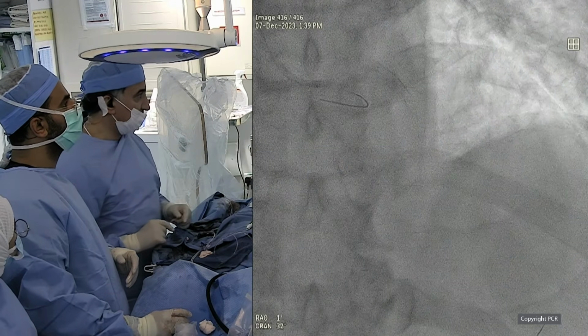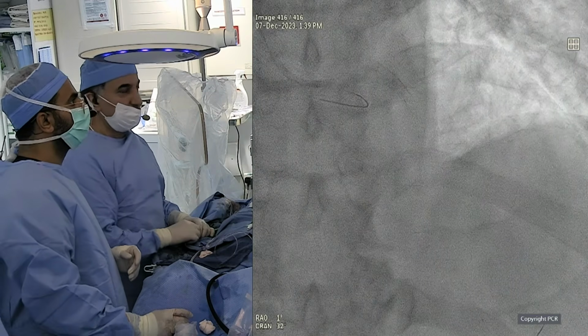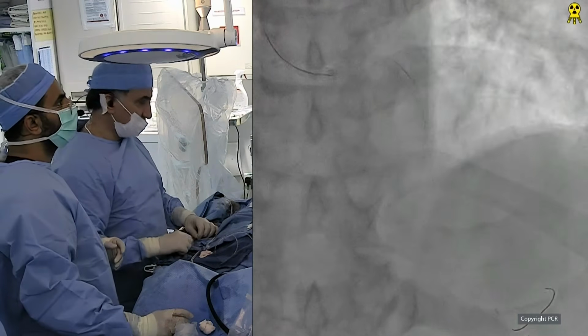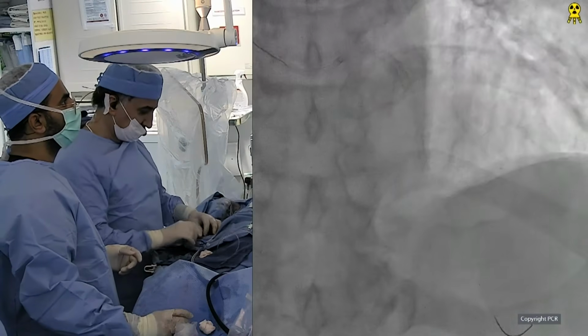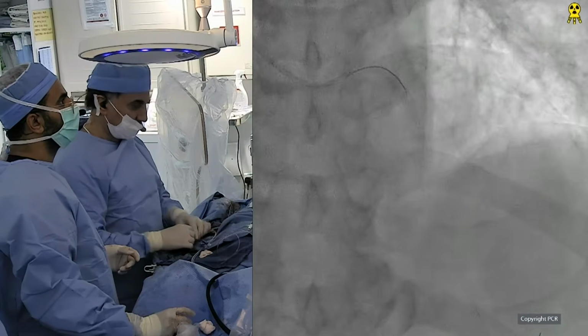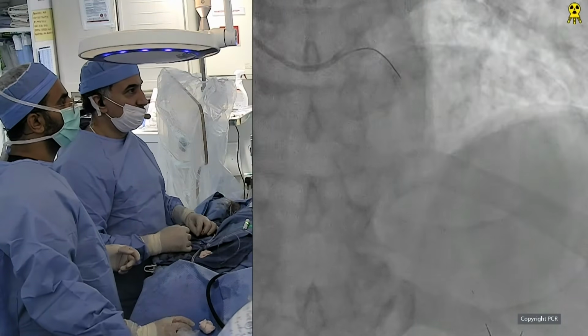Call the anesthesia. Let them help you. Done? Okay. I hope we can cross. Yeah, it might be. I mean, these wires, whilst they have made fantastic progress, are just not your standard guide wire, right? So it's a bit more difficult to handle.